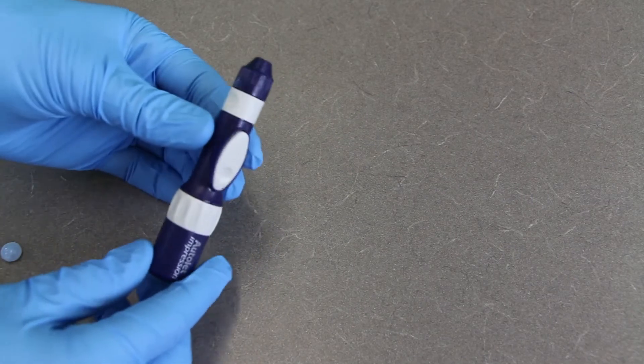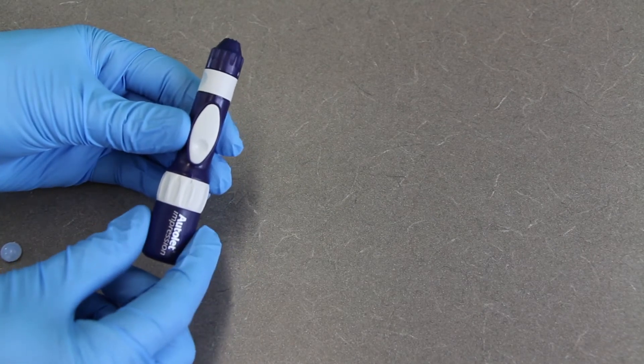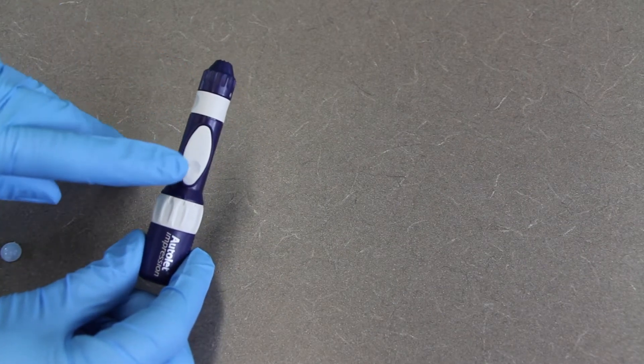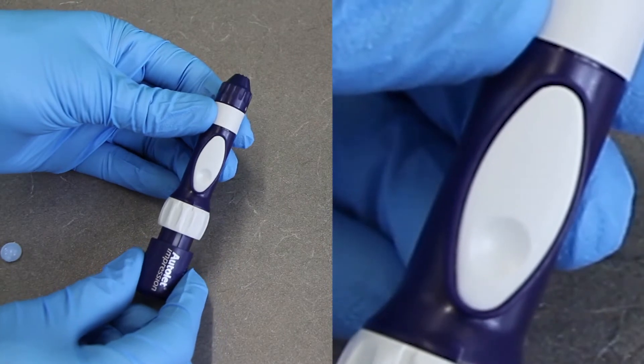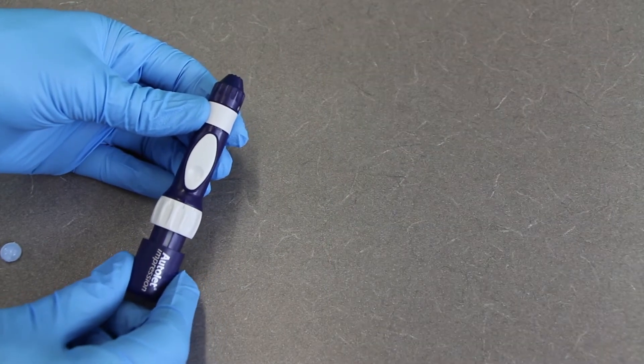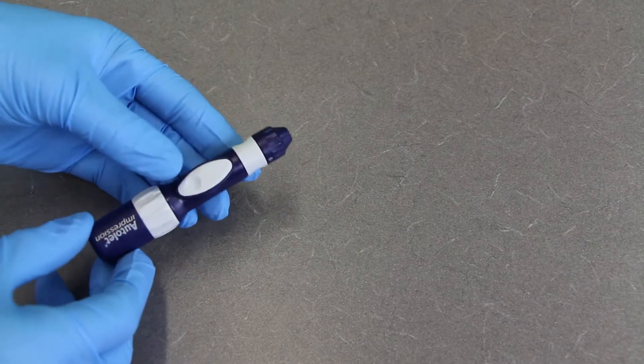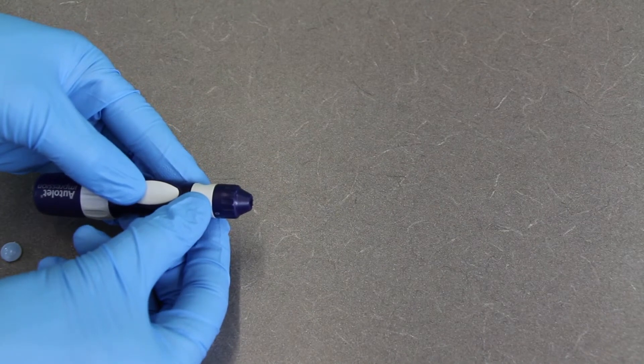In order to load the gun or to ready it, you're just for this version at least just going to grab this back part and pull back until you see this button here kind of pop out towards you. There it was. And then I can let go of the back and now it's ready to go. So now all I have to do is push on this button and you're not going to see it. There's a little tiny needle that's going to pop out the end of that.